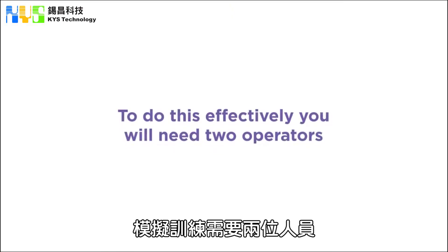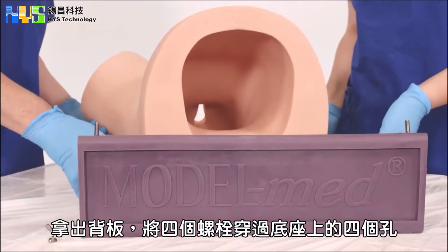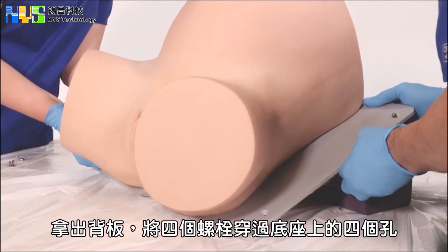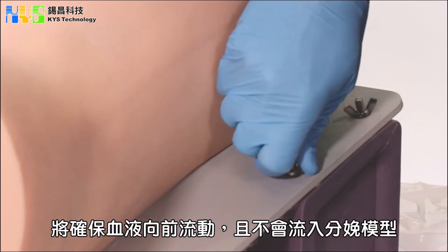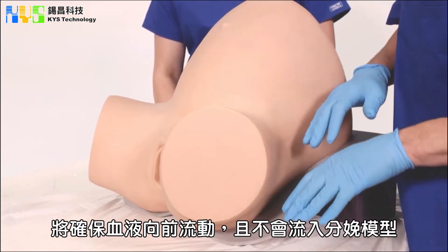You will need two people to run this simulation, who we will call the mother and the obstetrician. This is called the block. Place the four bolts through the back four holes of the base. Fasten with four wingnuts. This will ensure the blood flows forward and doesn't pool inside Sophie's Mum.